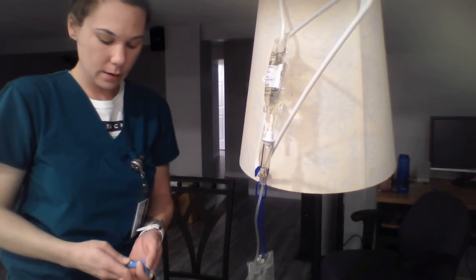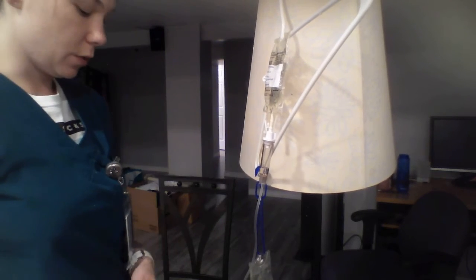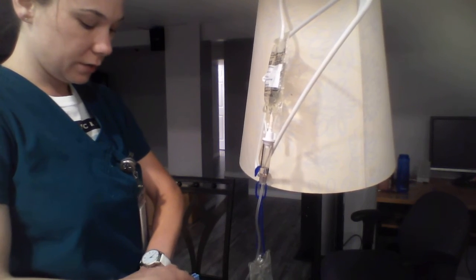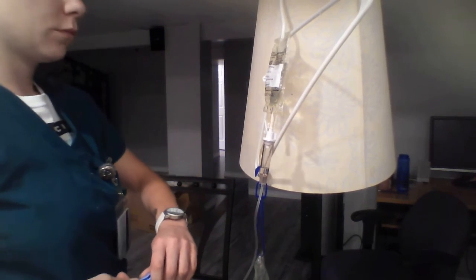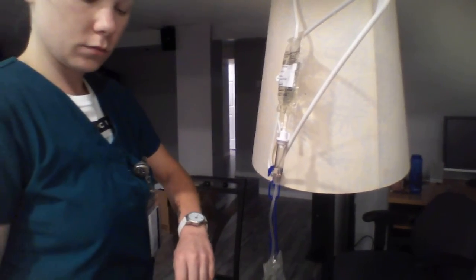open my main while I'm looking at this one. And I'm going to assess for it running at 25 drops per minute. Move this closer.